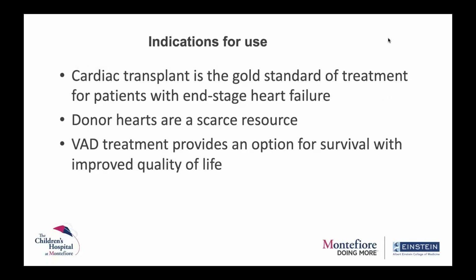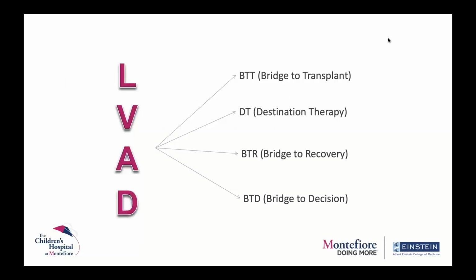What are some of the indications for using ventricular assist device? So again, we all know that cardiac transplantation is the gold standard for treatment of patients with end-stage heart failure, but we know that donor hearts are a scarce resource. So sometimes patients have to wait longer on wait lists to get a donor heart. And ventricular assist device treatment provides them an important option for survival, and not just survival, but with improved quality of life. And this is why we use VADs.